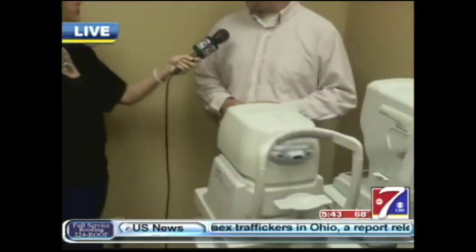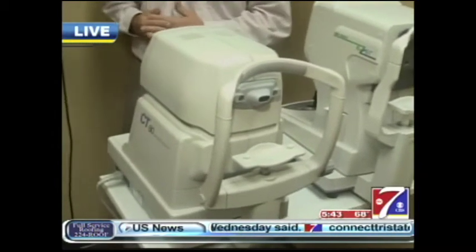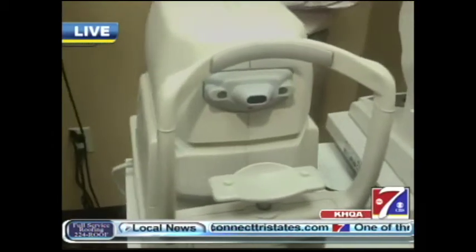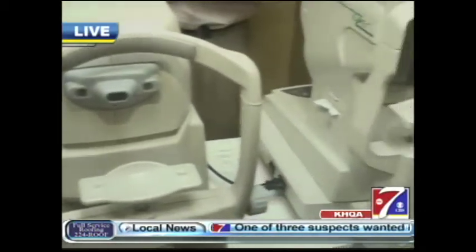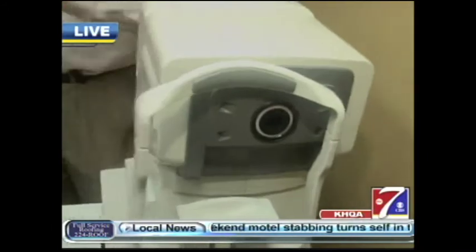And what is this machine? This is an NCT glaucoma pressure test machine. We don't do that on the children unless it's recommended by the doctor for a certain age. So if you're coming with your kid and you say, I'm going to get mine done first, you need to make them aware that they're not going to get this done too. Yes, unless it's recommended by the doctor for certain issues. If the doctor needs to, they can dilate the patient to do a further test for glaucoma. And this test is the little puff of air in your eye that everybody, at least I, wince at. You should try that. No, maybe a little bit later.